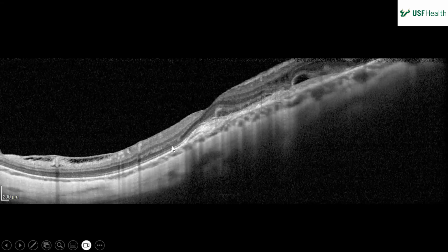Okay. So this one looks maybe like a vertical cut. So all the way on the left side of the screen, I don't know if it looks just like maybe the hyaloid. Yes, that's still there. Yeah, that's a myopic thing. So the eye's starting to bow out a little bit, and you're starting to get that little tractional myopic thing, which I don't think was there before either.